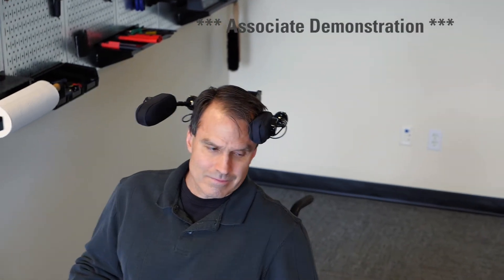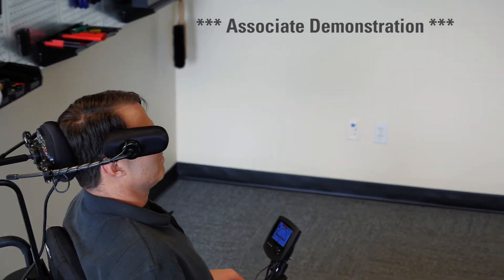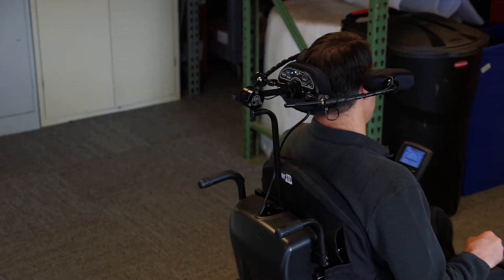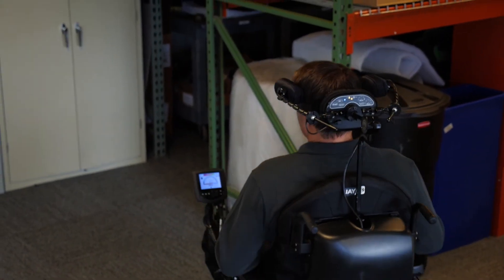For example, take a patient in the early stages of ALS. They may be able to press against the pads to control the chair. However, as the disease progresses and they begin to lose strength in their neck muscles, they can simply move to a proximity-driven platform without changing to new equipment.